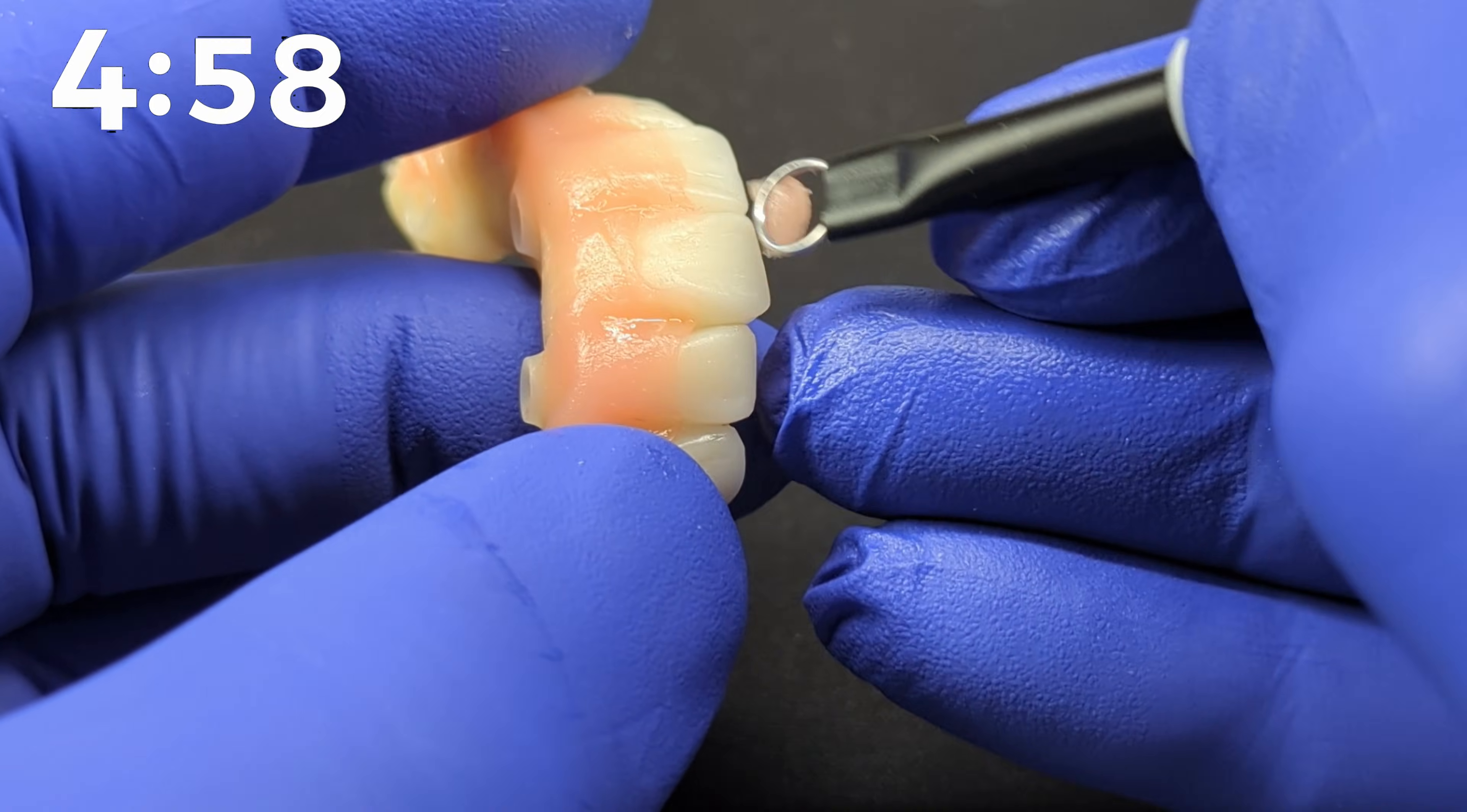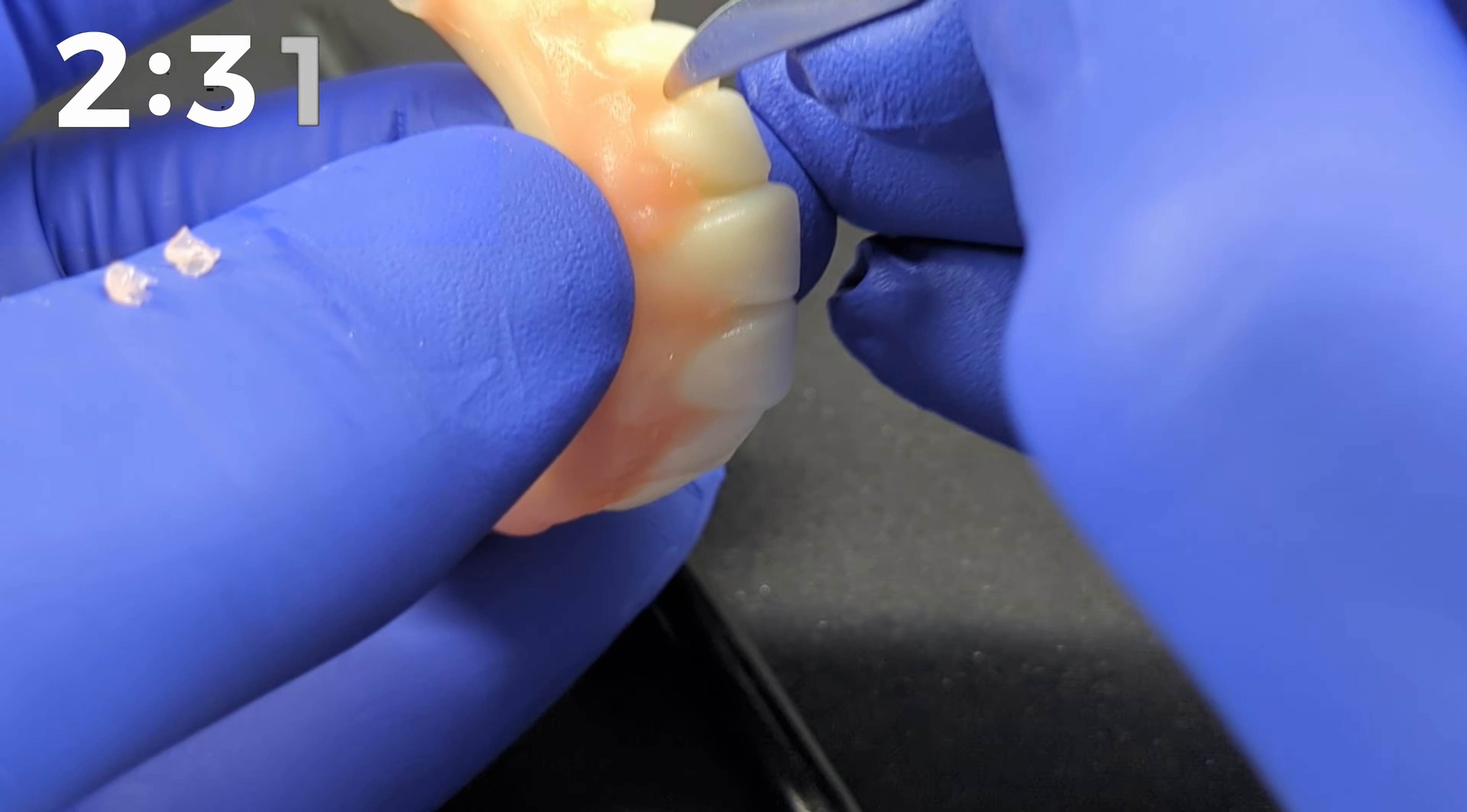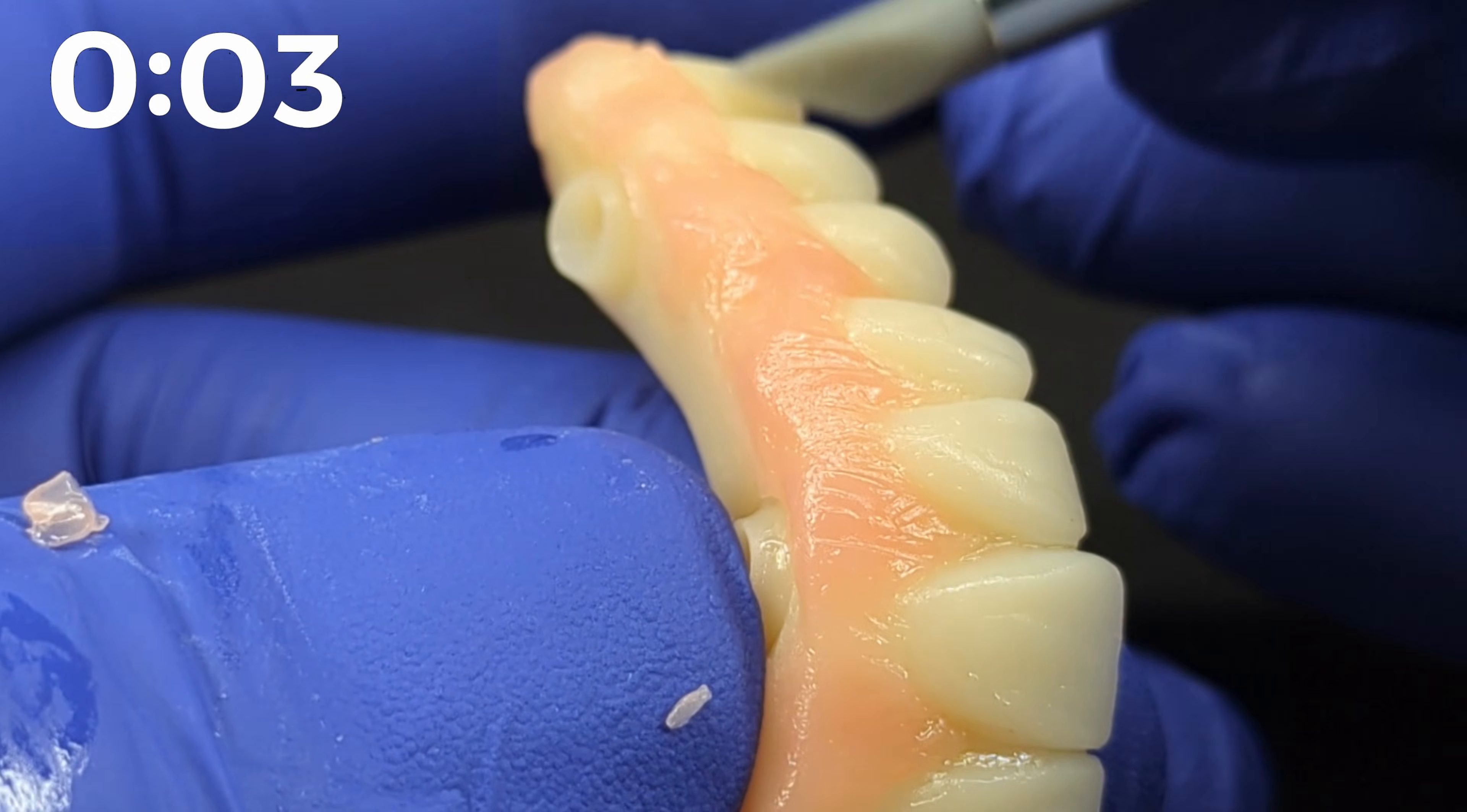Be sure no material gets into the multi-unit interfaces, because it will be difficult to clean those out. By using the Harvest Dental Papilla tool, I then model the CEJ of the gingiva. The tool has a perfect round end to mimic the gingiva. I will show you later how I modified this tool for optimal performance, as it can sometimes tear and smush the EasyGum instead of cutting and modeling it. As you can see, there's plenty of leftover material to apply in areas of insufficient thickness. The total working time before EasyGum hardens is about 10 minutes under normal lab light conditions, avoiding direct sunlight and large windows. Using a fine tip spatula, I remove excess material between the teeth and fine tune the CEJ areas with a clay modeling tool with a fine tip. Sharp tip clay modeling instruments help to move and position small areas in the gingiva and further thin out areas if needed.